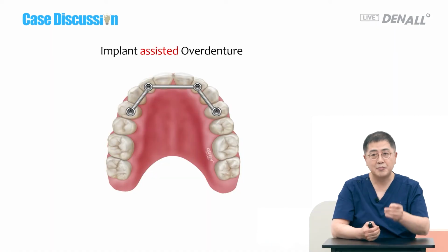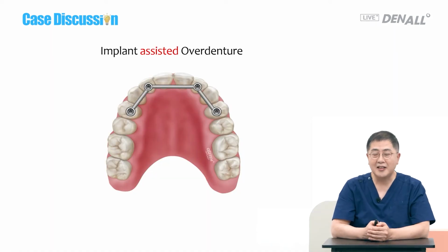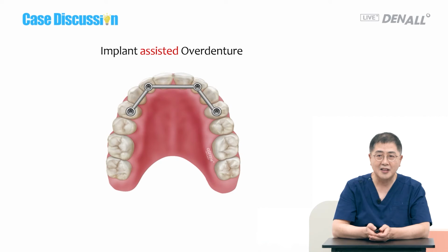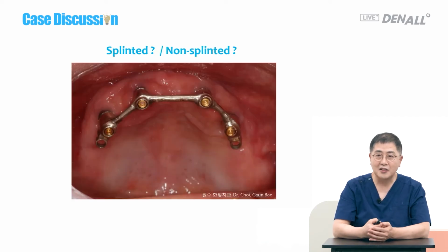For this, there are controversies in papers because overdenture on maxilla has high rate of failure. So the papers acknowledged using 4 implants, implant-assisted overdenture. Otherwise, there are high rate of failures. I don't have a case.